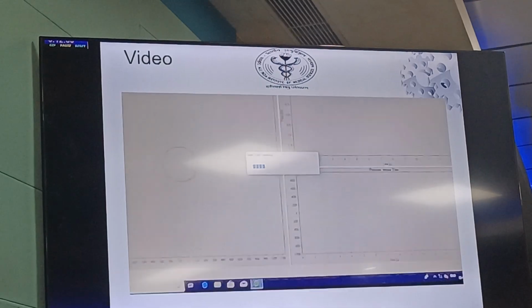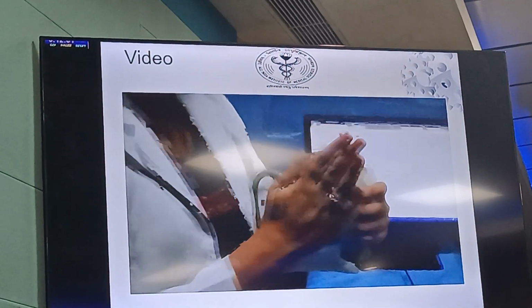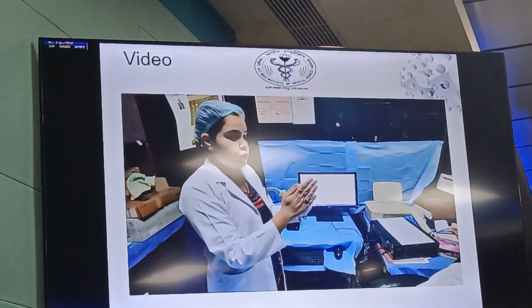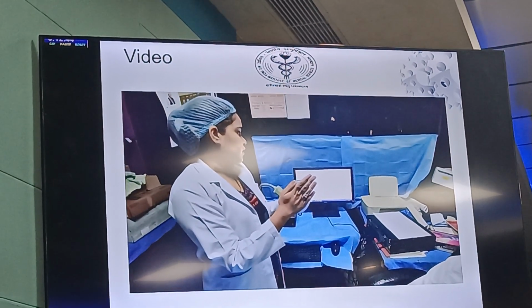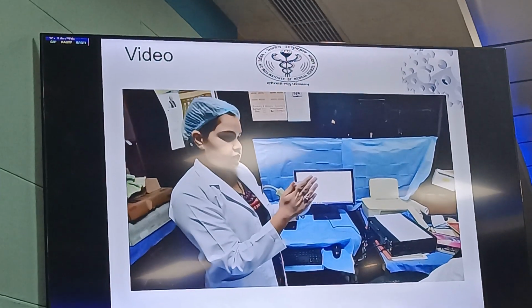And then we have to place our palm onto the mask. It should be tightly fitting and there should be no air leak. The machine will calibrate itself to mask zero. If the mask is larger than the size of your palm, in that case, you can place it against a flat surface.